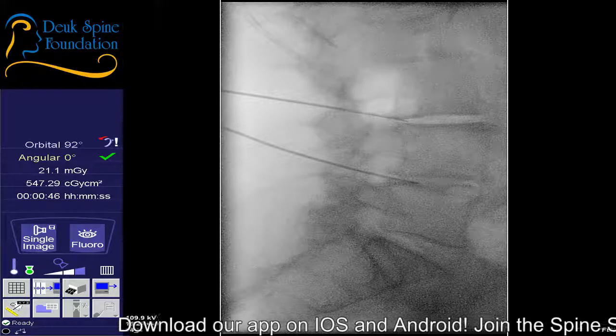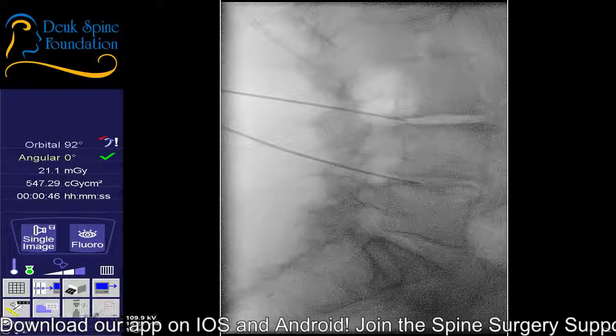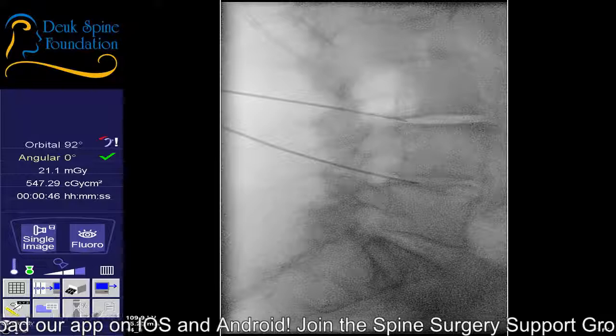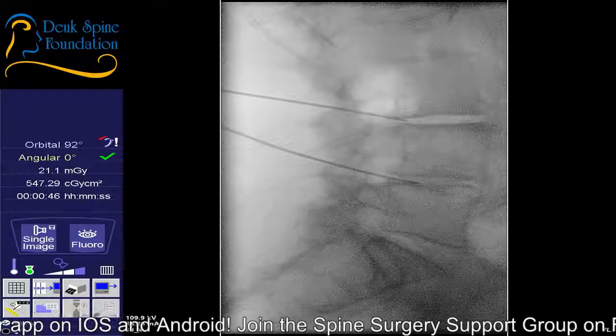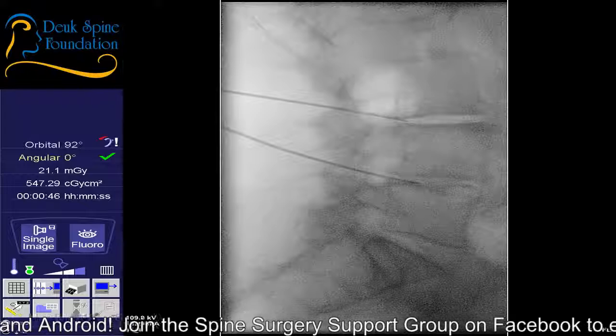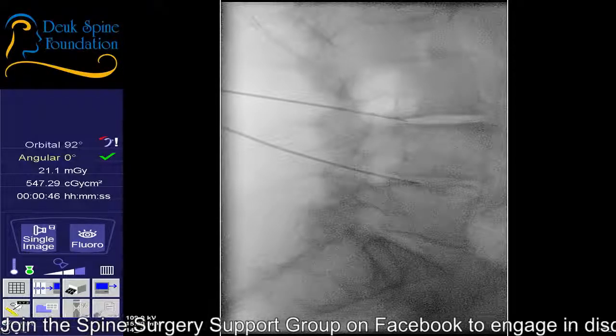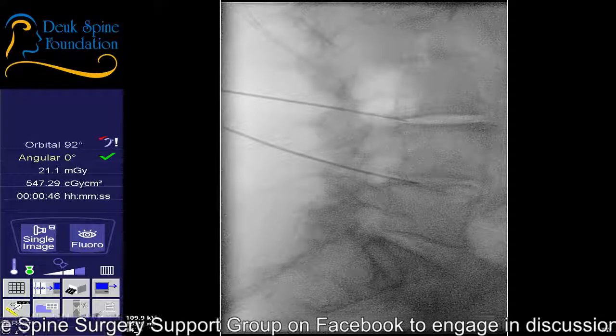I've been here before. Are you awake? I just have a hard time getting in where I want it to be into the disc, but once we're past the annular tear, we're safe, and we're in a safe place to proceed. But I'm just not going to, oh, there we go. There we go. Yeah, now we finally get it.